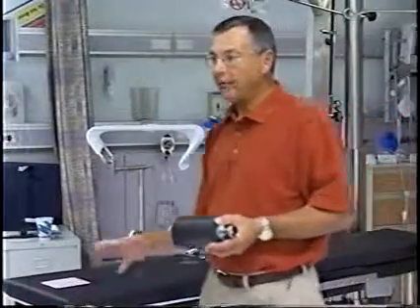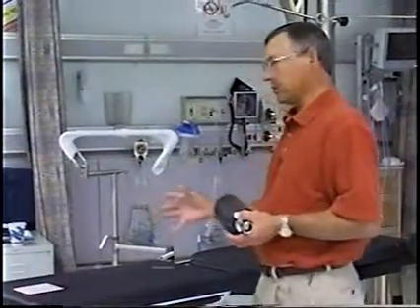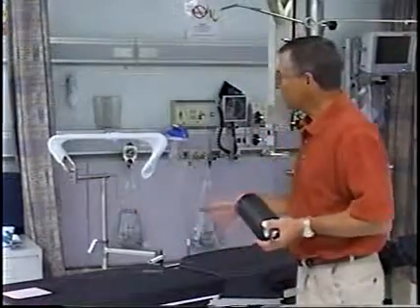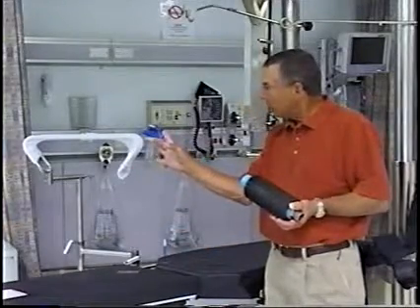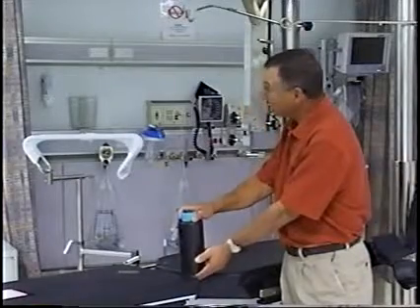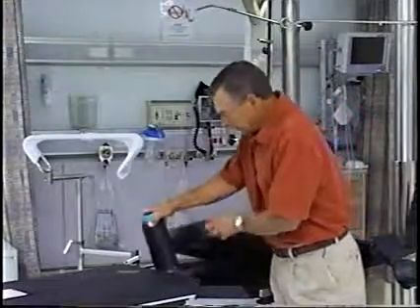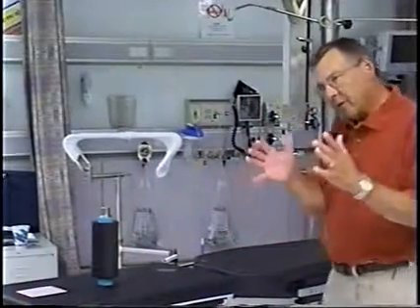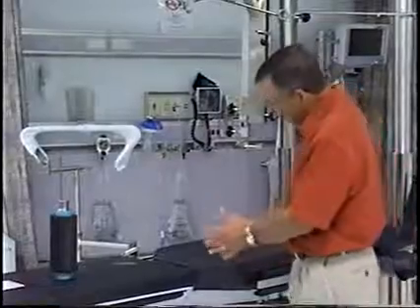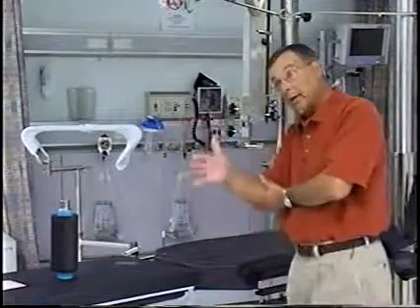There is another device that you have in the OR someplace that came with this, called a lateralizer or an offset device. I don't know if you've seen that, Pat, but it's a little stainless steel adapter about that long that goes into here that will allow you to move the hip out to one side. If you've got a very, very narrow hipped patient, let's say a little 85-year-old lady in here, and she's got a very, very narrow pelvis, very narrow hips, and her hip is right here. Well, because the doc is shooting through this, even though it's translucent, he's going to get an artifact.